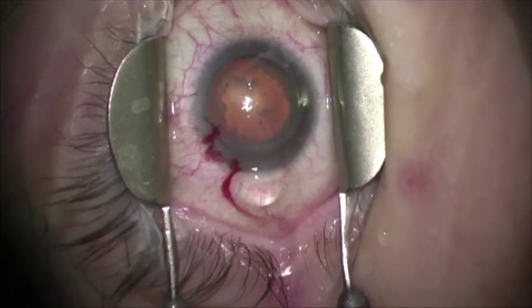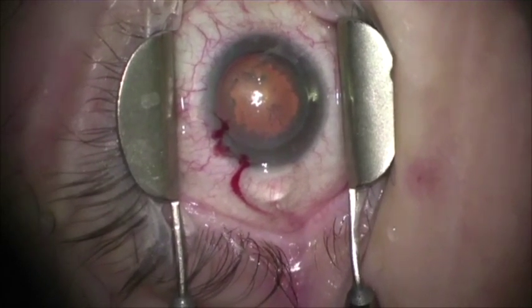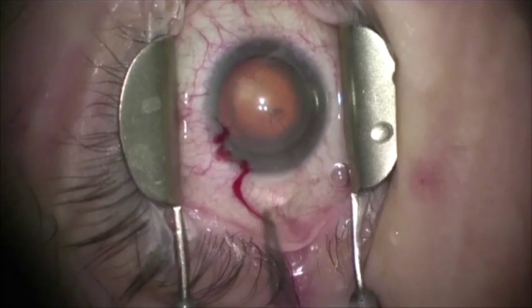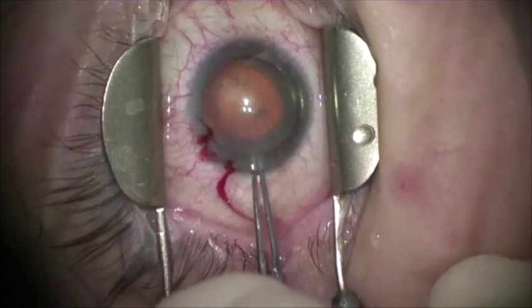Here it is after it was removed. View-in was much clearer, as you can see, and the capsulorhexis and cataract surgery could be performed.